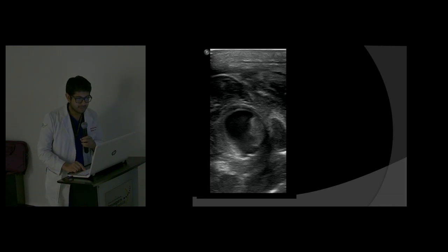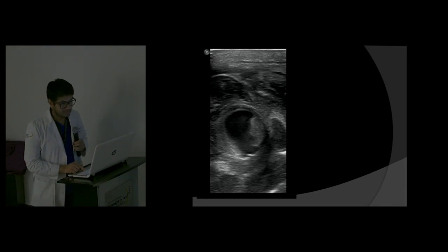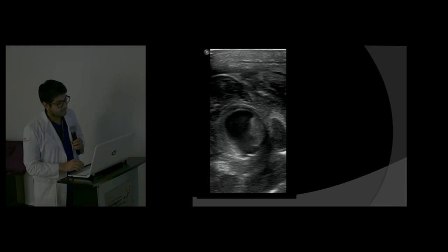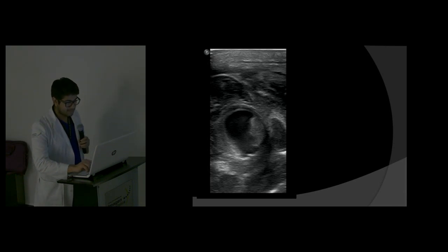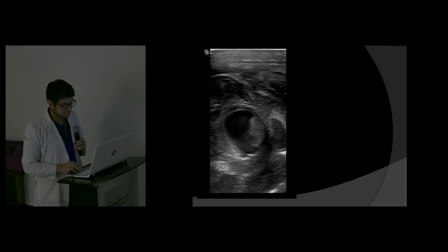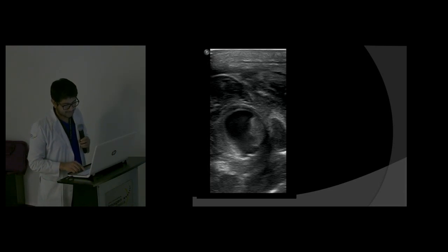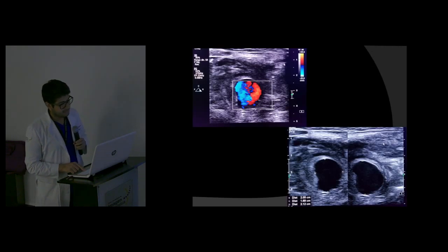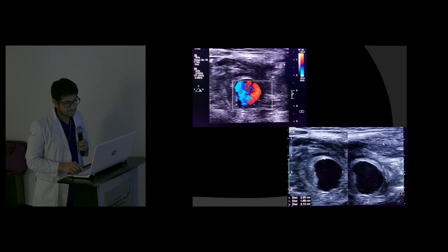We decided to make an ultrasound evaluation. It came to our attention this image at the external carotid artery, an anechoic and hypoechoic round image with a central Doppler sign simulating a yin-yang, associated with fat stranding and local edema. Ultrasound examination of the external carotid artery using a linear probe in grayscale and Doppler color. Okay, the yin-yang sign. And the other image of the yin-yang sign, and the lesion was approximately 2 centimeters.